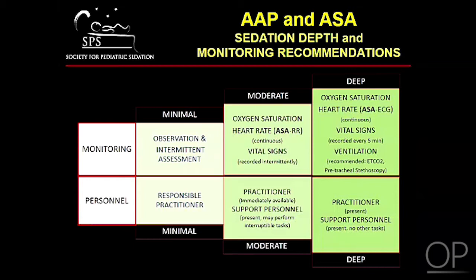quickly if needed. For deep sedation, the recommendations for moderate sedation hold, with the addition of further continuous measurement of ventilation using either capnography or pretracheal stethoscopy. The ASA also recommends electrocardiogram monitoring for deep sedation. For deep sedation, support personnel must also forego other tasks, as the potential for an adverse event is higher. Monitoring should continue until the patient returns to their baseline status.